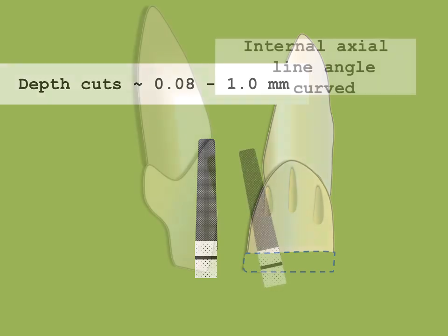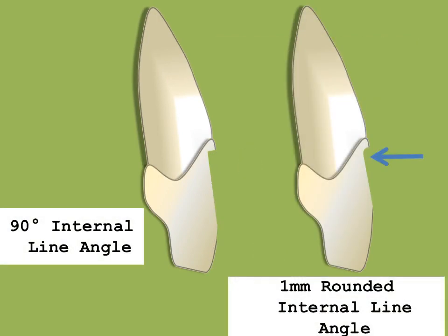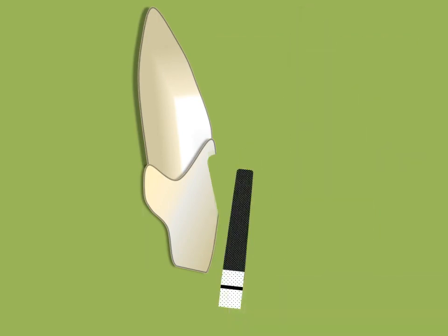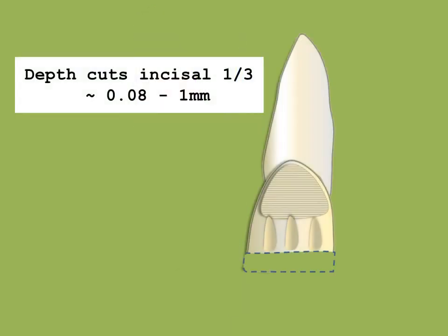Reduce the labial as far into the embrasure as possible without abrading the adjacent tooth. A 90-degree shoulder may be used for the ceramo-metal crown if the porcelain butt margin is to be used. After completing reduction of the cervical two-thirds of the labial surface, the incisal one-third is reduced. The burr is oriented parallel to the facial surface. Again three depth grooves are placed. The entire labial surface of the tooth is reduced one millimeter. Carry the reduction as far into the embrasure as possible without abrading the tooth. All care must be applied to prevent abrasion of the adjacent tooth.